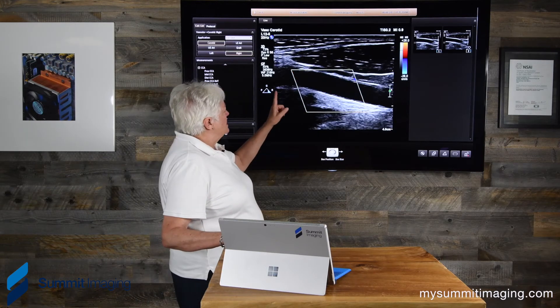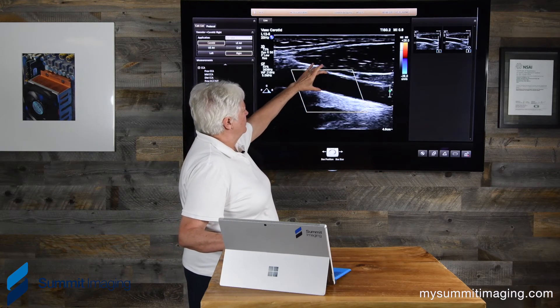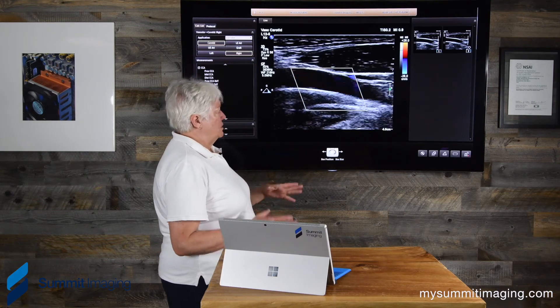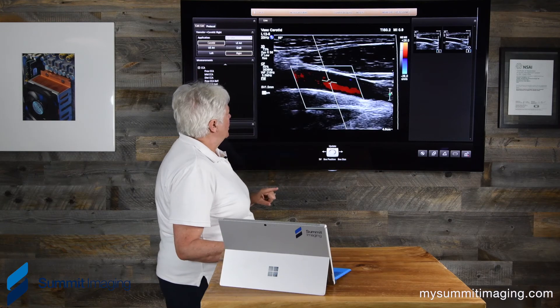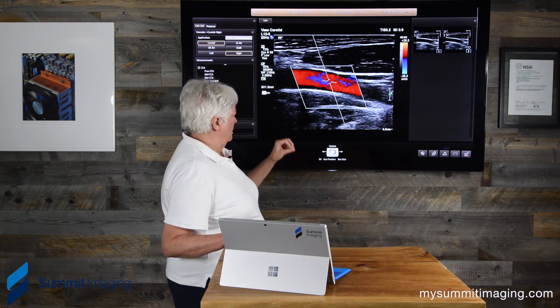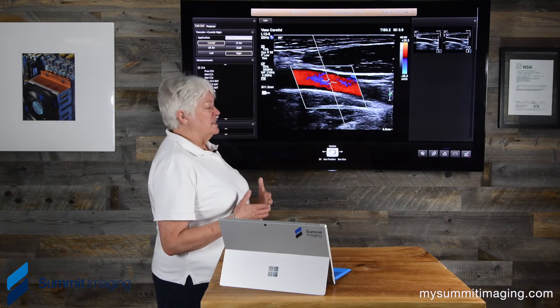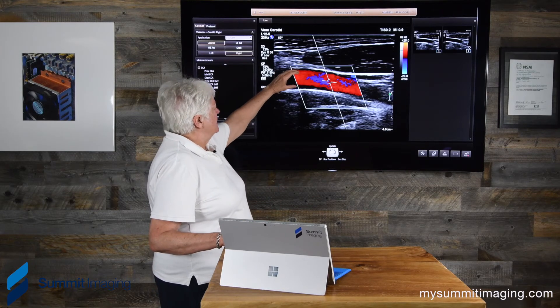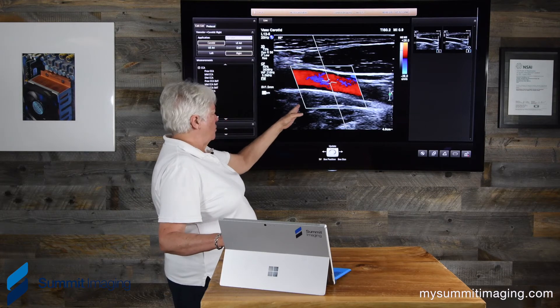Now we have color Doppler, and this is showing blood flow in the carotid toward the head of the patient. What we want to see is a completely filled vessel — we definitely don't want any areas where there's no color, because that could be a filling defect related to plaque or some kind of arterial pathology. We want the color to be predominantly the main color, which in this case is red, but occasionally it will have some higher velocities, and that's okay because of the heartbeat which forces blood at a faster speed.